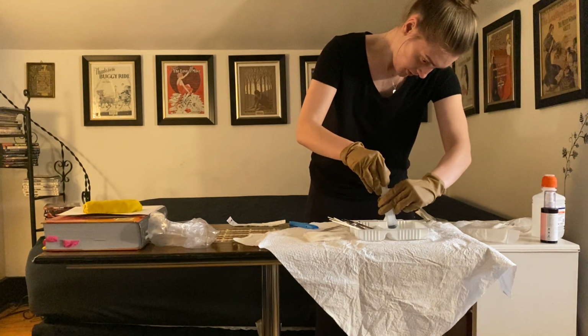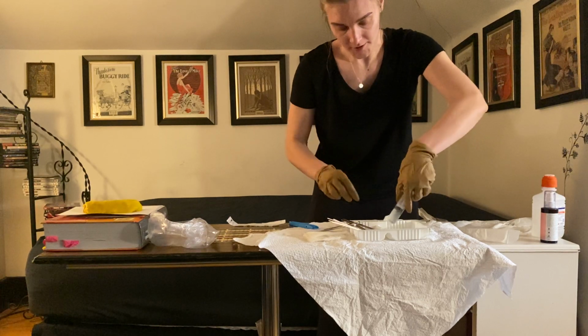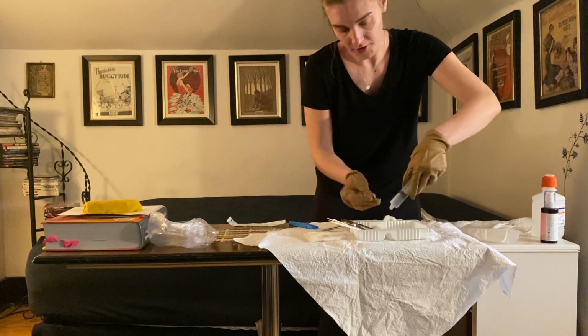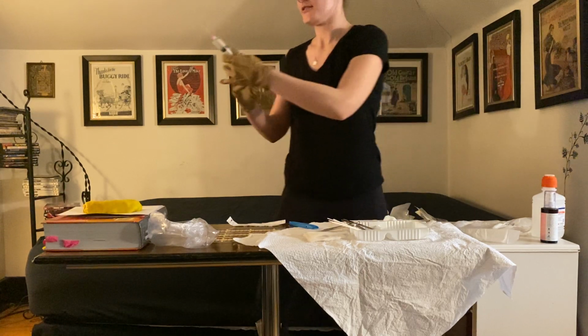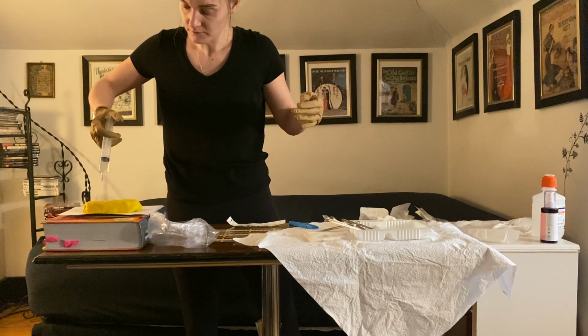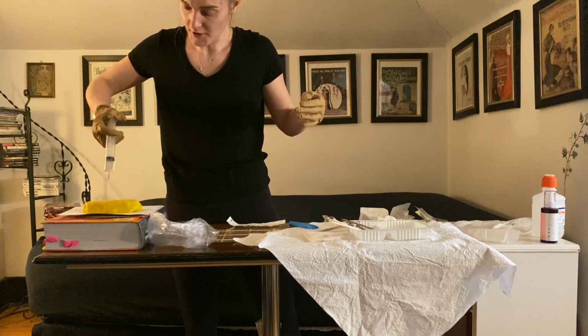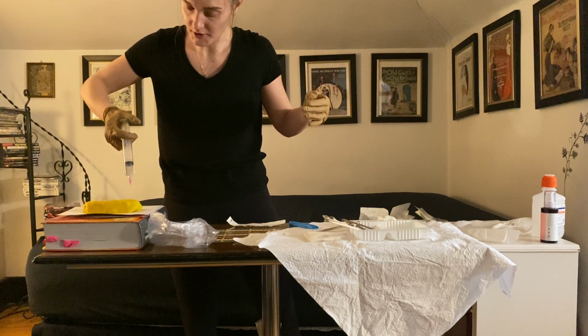So drawing up 10 cc's. And again, being mindful because I don't want to get any drops outside the tray. And then from about 10 centimeters away, and then being very careful because I don't want to get it outside the peri wound. Right, I don't want to let it hit the peri wound because I don't want to bring anything new in.